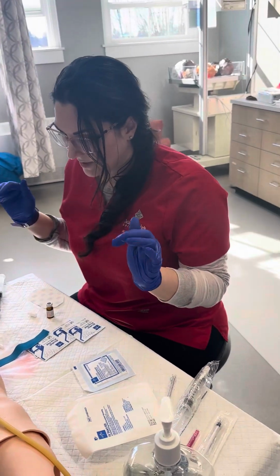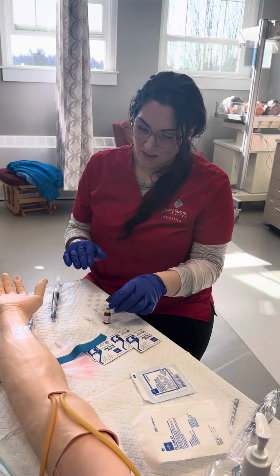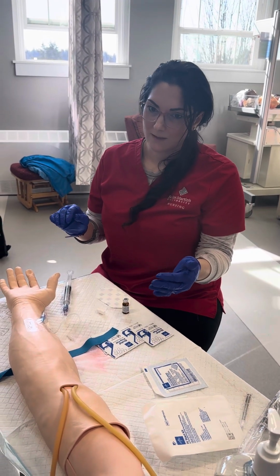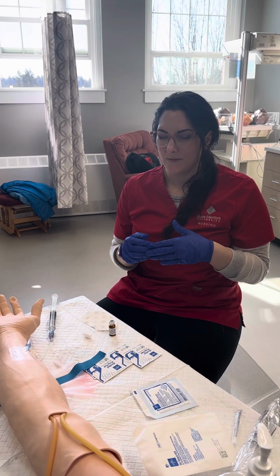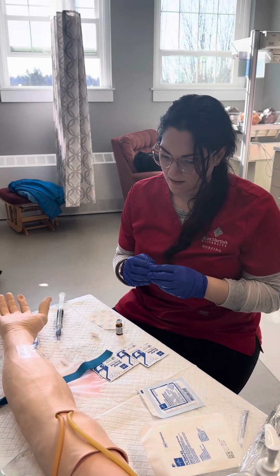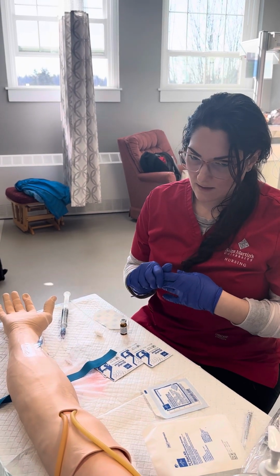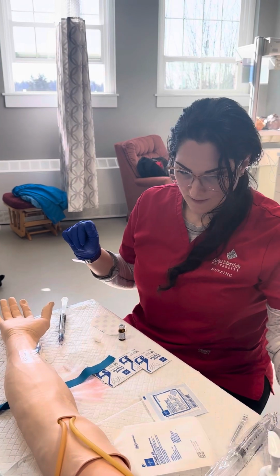Okay, I have the right patient, Scott Mingus, the right medication, morphine, the right time, the right route, the right reason, the right dose, which was 0.3 milliliters, and the right time now, okay?